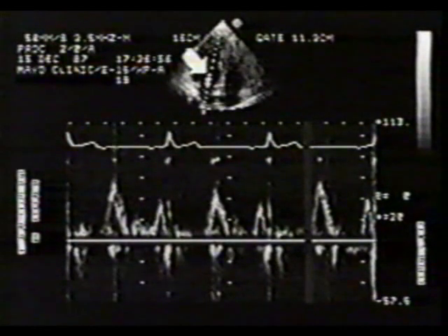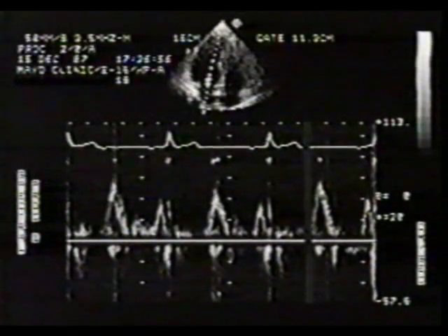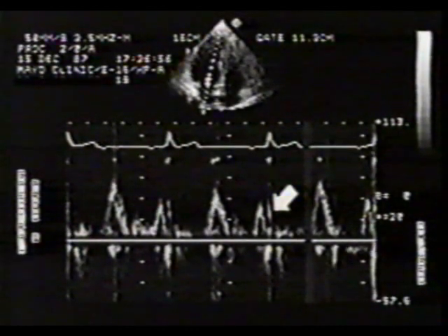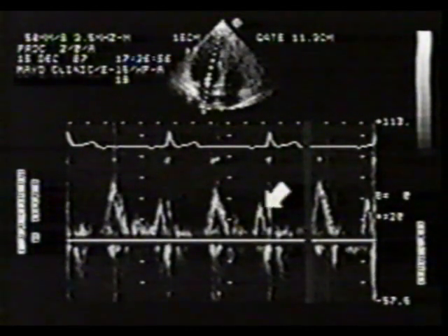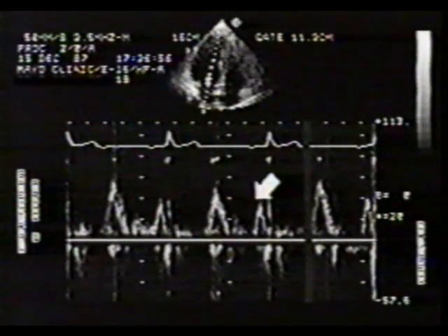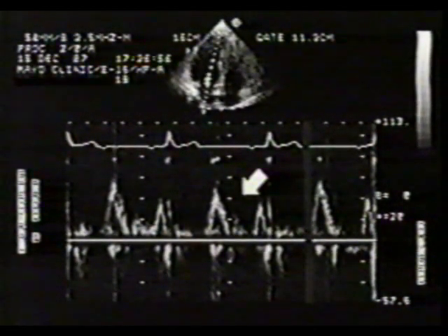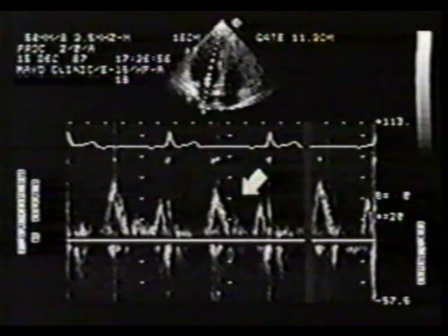As the sample volume is moved toward the left atrium into the mitral funnel, the mitral closing click also becomes apparent. Note that the E velocity has become reduced to 0.45 meters per second, and the A velocity is essentially unchanged. Therefore, the E to A ratio has decreased.